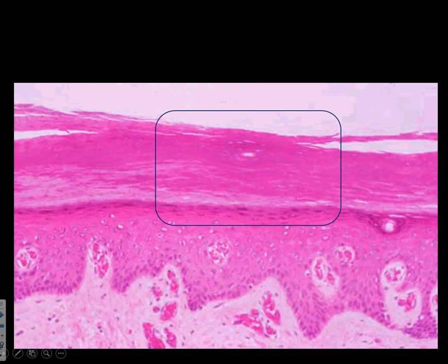All right, this one. First off, we can tell it is epithelial tissue because we have an apical surface. It's not attached to anything. And the basal surface runs about here. Let's see. Hard to see on my screen that I'm using in here. Actually, no, that would be up here. There we go. The basal surface.